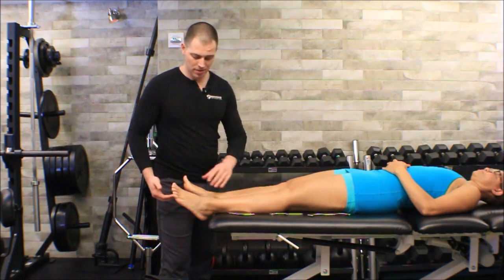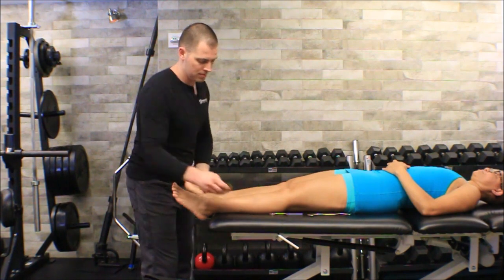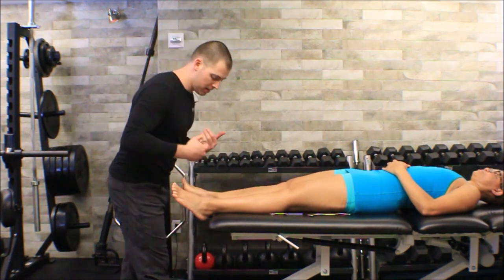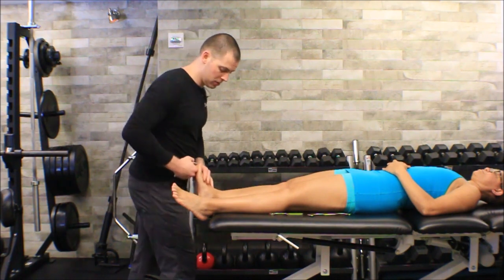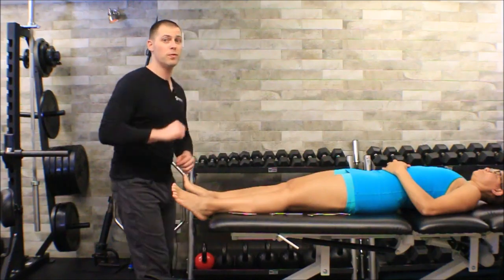Supine is a little easier, so you're going to have them pull up their foot as you pin, pull up their foot as you pin, and then of course you can add overpressure by placing your chest or the bottom of your rib cage over the top of their foot and pulling back their toes. Stay tuned for the close-up recap.